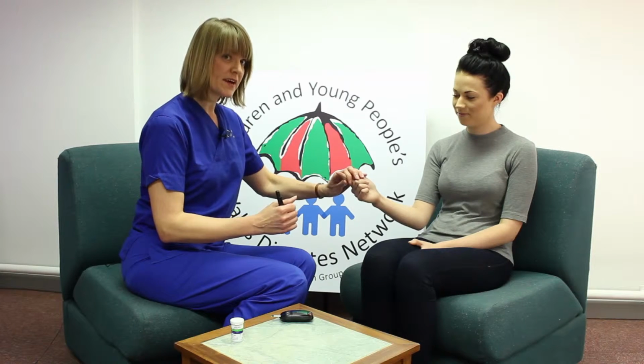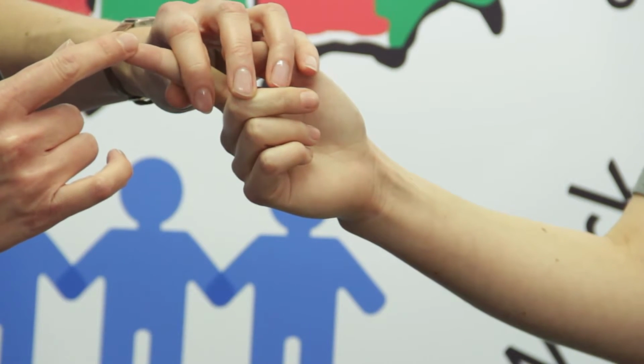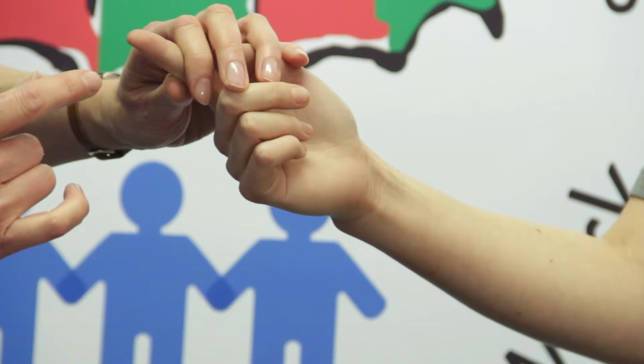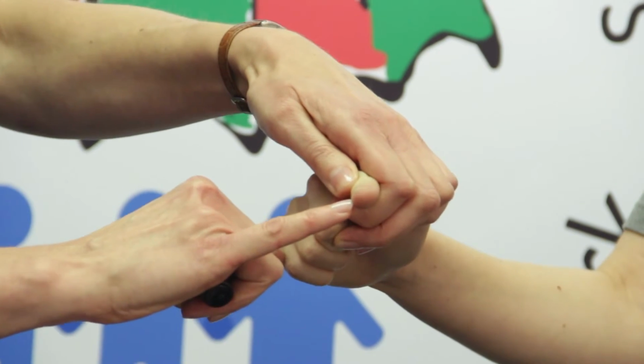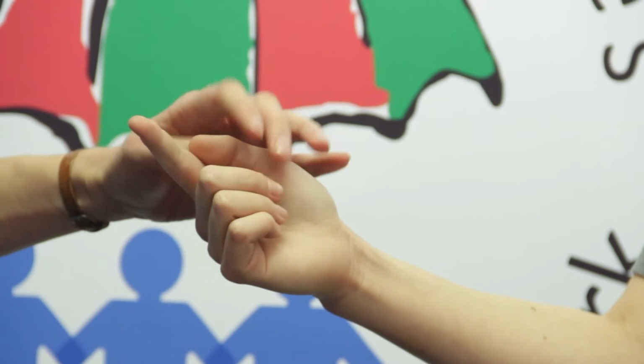When you prick the finger, we recommend that you use the side of the finger, not the squashy pad, because it's on the squashy pad of the finger that you have most sensation. We also recommend you stay away from the nail as well. You can use any finger to do a blood glucose test, or the thumb.